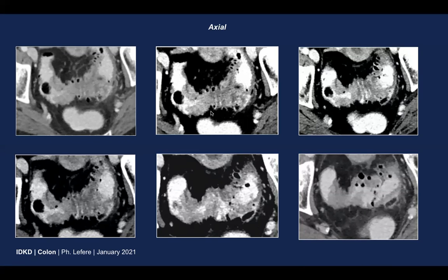Another important feature is to look at the presence of diverticula, which we see better in the broader windows. Diverticula are clearly visible all over the proximal zone, whereas in the distal zone, we don't see any diverticula — absence of diverticula in the distal wall thickening.